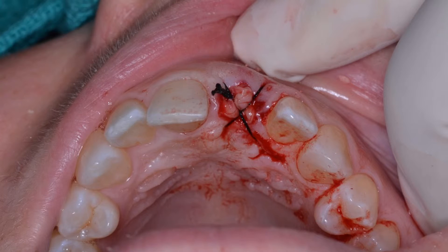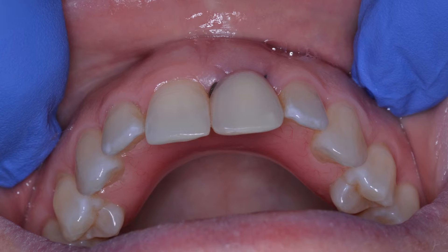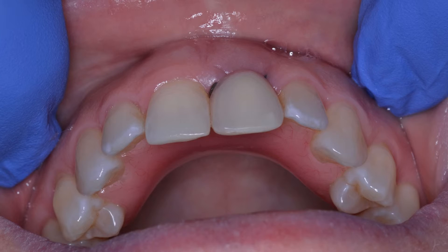We'll have some pictures of this patient at the seven-day mark. You also want to place the prosthesis for this patient. You can see that I have placed the transitional prosthesis, and from an aesthetic perspective this is absolutely acceptable. In my own personal experience, the problem with a fixed prosthesis is you're normally cementing them down with something temporary and patients are always knocking them off. The removable prosthesis works really well. Another option I like using is an Essex retainer — basically like an Invisalign retainer — where you take some composite and put the patient's tooth inside, so it's aesthetically acceptable and can help in the development of a nice pontic site as well.